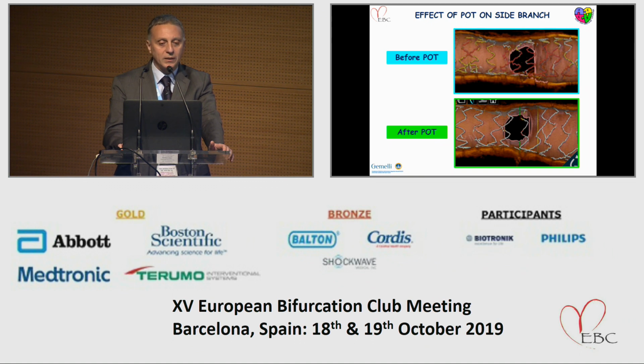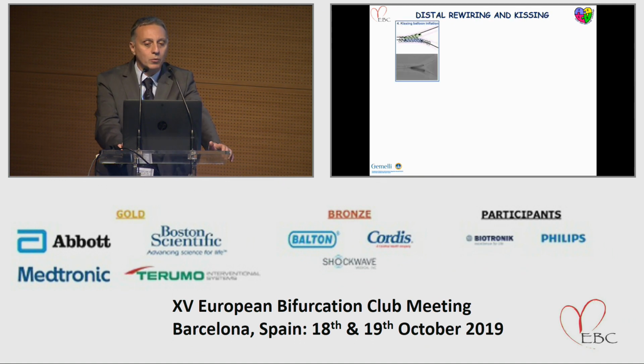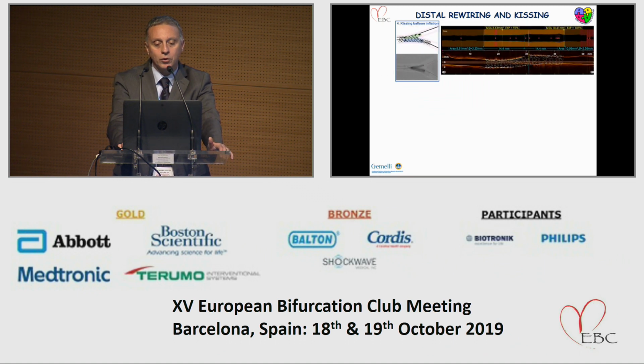So it is something that really deserves attention in my mind. Then what we performed was distal rewiring and kissing balloon inflation. I don't want to bore you with all the steps which are required, we already showed. This is the result we had.